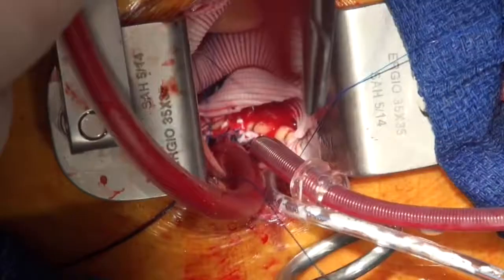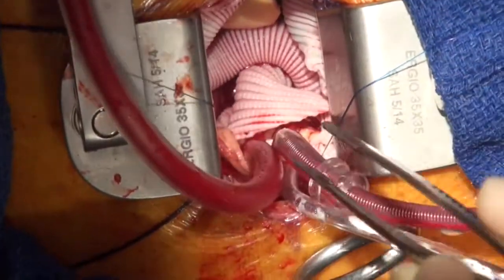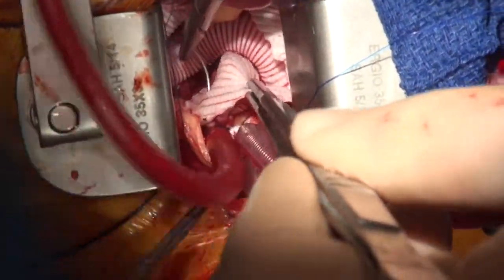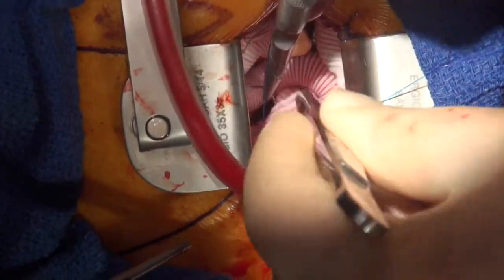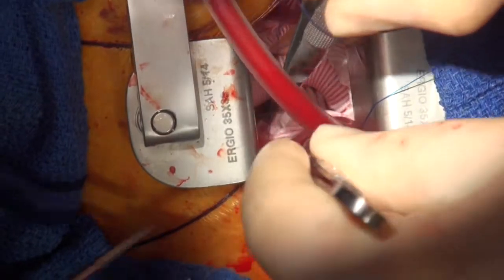In the way of the suture line we have the antegrade cerebral perfusion catheter and also a suction catheter down the arch of the aorta into the distal aorta to create a bloodless field. Shortly we'll be taking these out to complete the distal anastomosis.